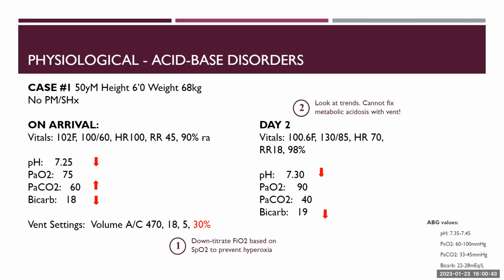What Courtney was pointing out earlier is that you don't have to shoot for all these numbers looking exactly like the reference book says, but rather try to match it to the patient, identify what the derangement of physiology is, and ask: are we moving in the right direction or the wrong direction? Does anyone want to take a guess why the pH is 7.3?